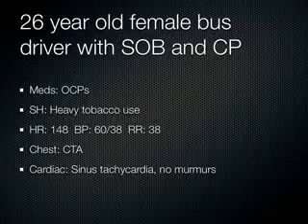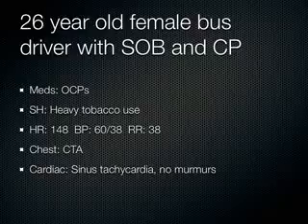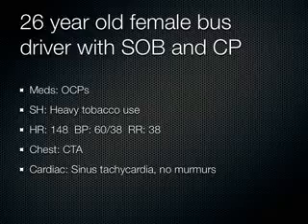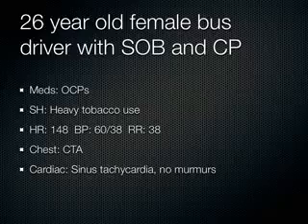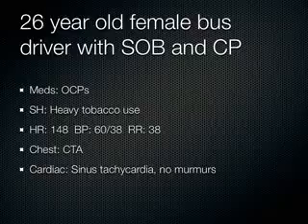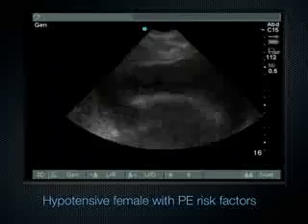And on ultrasound, pulmonary embolism looks like you just have a gigantic right ventricle. In other words, normally when you compare the right side of the heart to the left side of the heart, the right side is about 2/3 the size of the left side. So the RV should be about 2/3 the size of the LV in a normal patient. But with RV strain, which you see with massive pulmonary embolism and also pulmonary hypertension, the right ventricle gets very large. In fact, it approximates the size of the left ventricle. So keeping that in mind, I plopped the probe down on the patient, and I saw this.